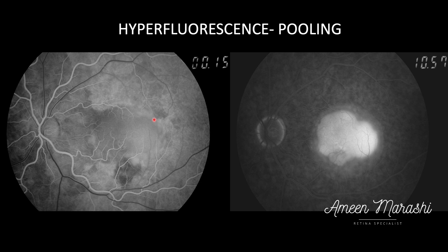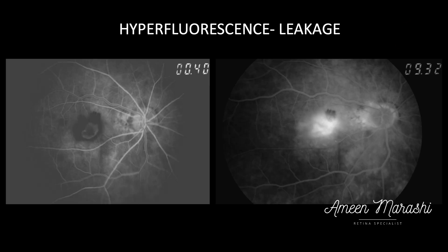In the early phase, we have an early hyperfluorescence that increases in intensity without increasing in size. This hyperfluorescence is at the sub-RPE level, while this hyperfluorescence is at the subretinal level.